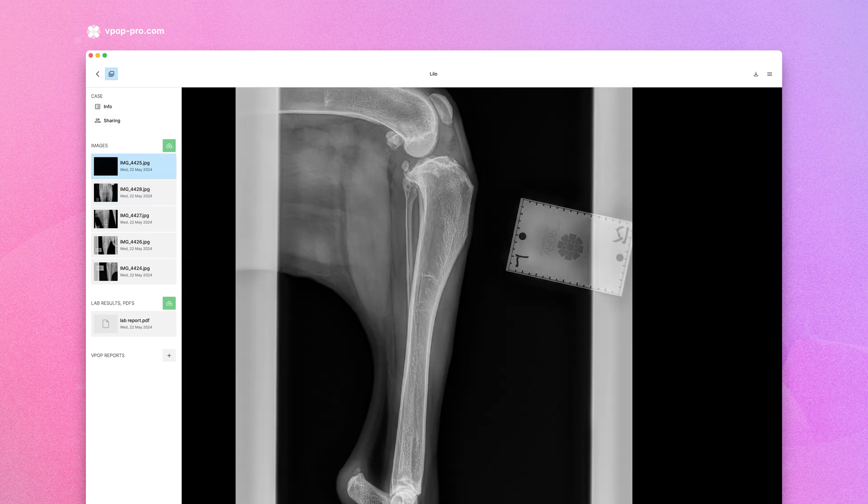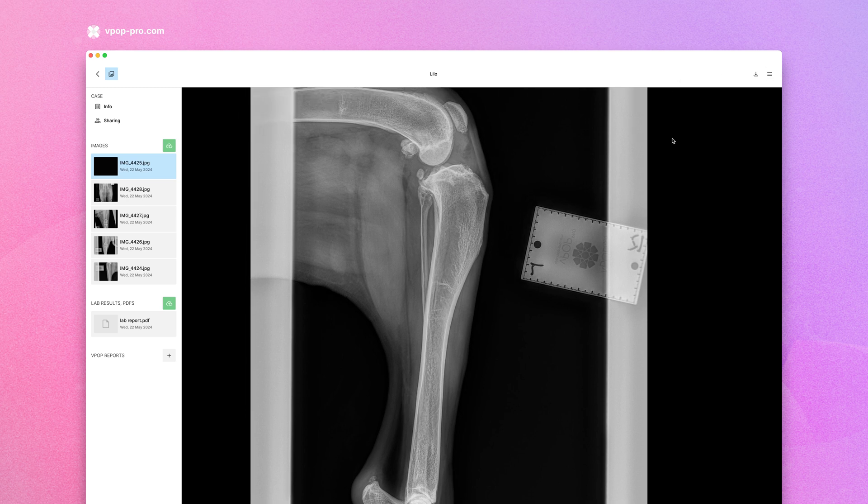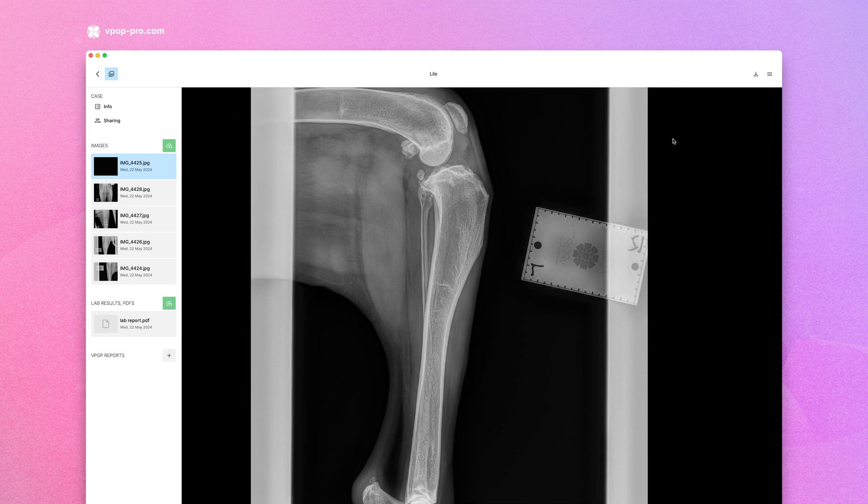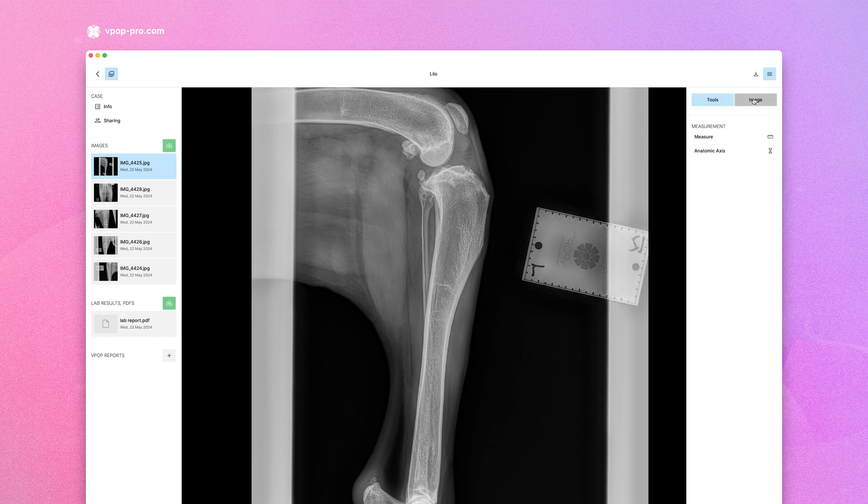After your images are uploaded, you'll need to calibrate them to ensure all your measurements are precise. Most DICOM images will be calibrated automatically, but for other images we need to calibrate them manually.